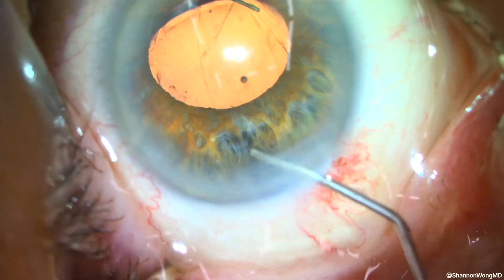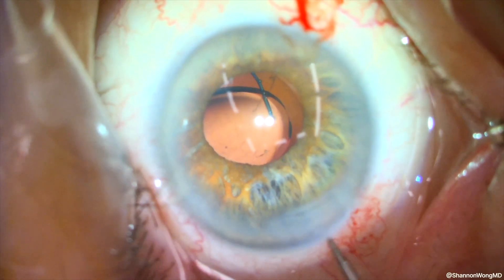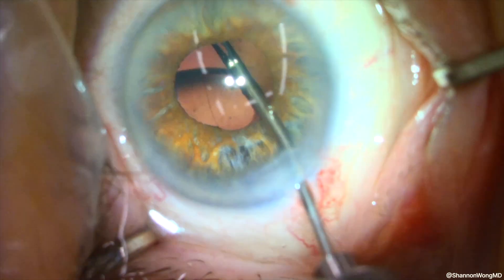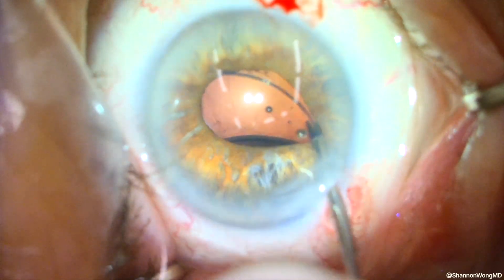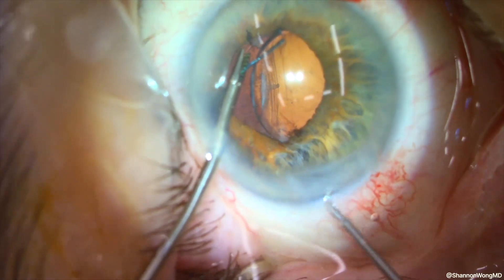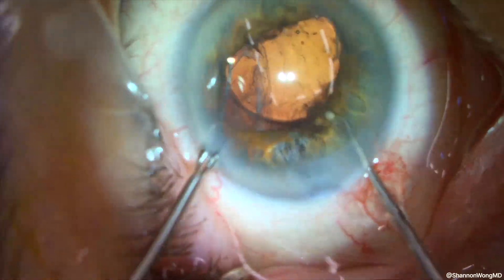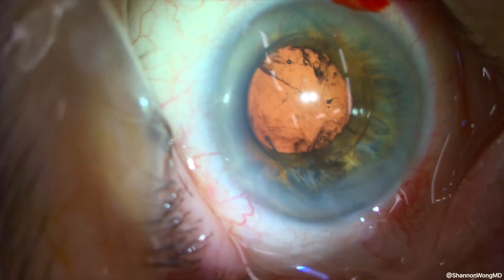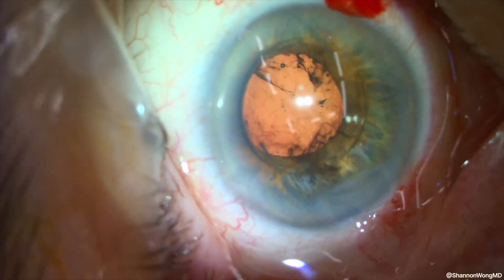As time passes, the optic appears to tilt, indicating that there is a lack of capsular support for the haptic that is obscured by the iris at 6 o'clock. We then use our micro forceps to grab the superior haptic and use the Kuglen hook to elevate the optic anterior to the iris. What we have is a capsule that is unstable, likely due to loose zonules. So we will not be able to place this lens implant into the sulcus unless we perform intrascleral haptic fixation to secure the lens implant.